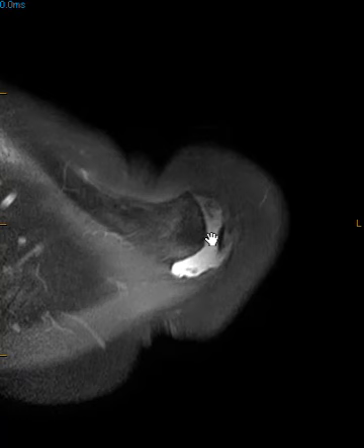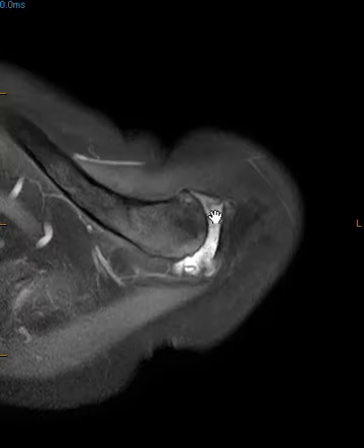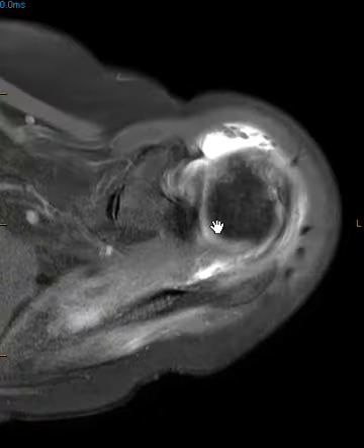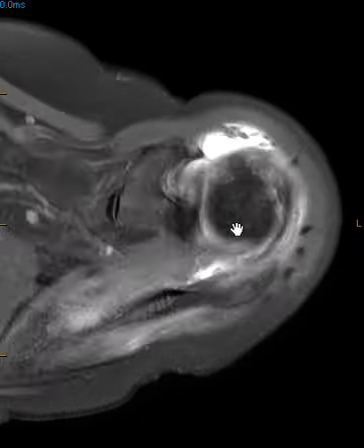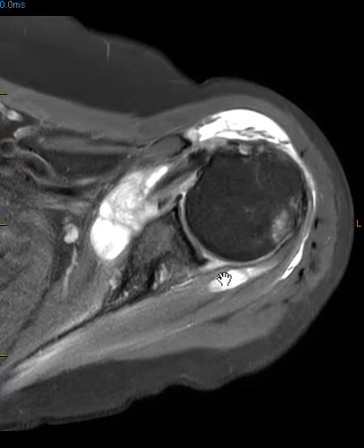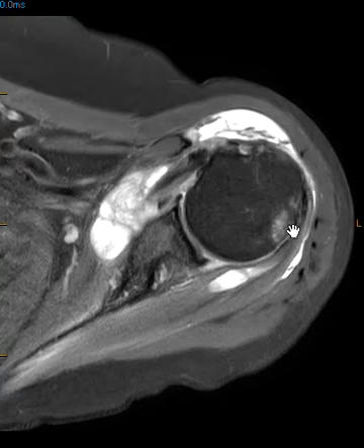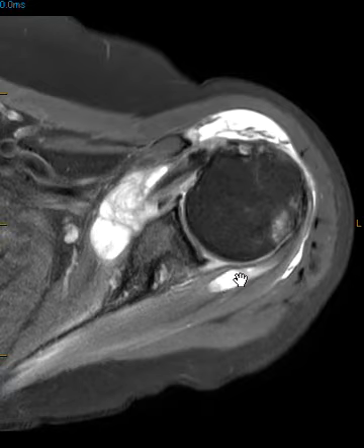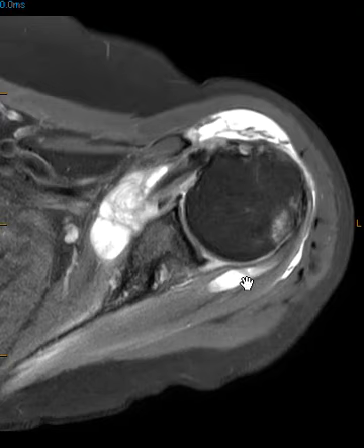They also had a prominent AC effusion with some synovitis, which goes along with the rheumatoid arthritis. Coming down, there are a couple of other interesting things: number one, there's a tubular fluid collection within the infraspinatus — this is what we call an interstitial tear. The fluid from the attachment usually tracks backwards between the longitudinal fibers toward the musculotendinous junction.